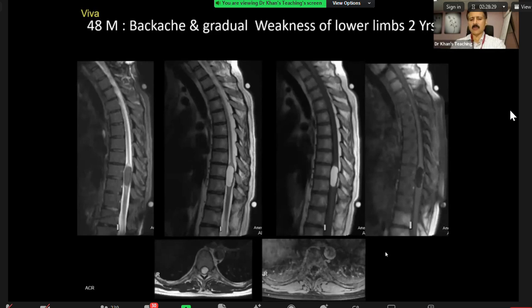And so a ruptured dermoid in the cord or in the spine can present upstairs in the brain, and I've shown you cases in the past also where there is something in the CSF space on a CT scan which will be darker than CSF, or on MR, and then you will ask for a cord sequence to rule out a ruptured dermoid.